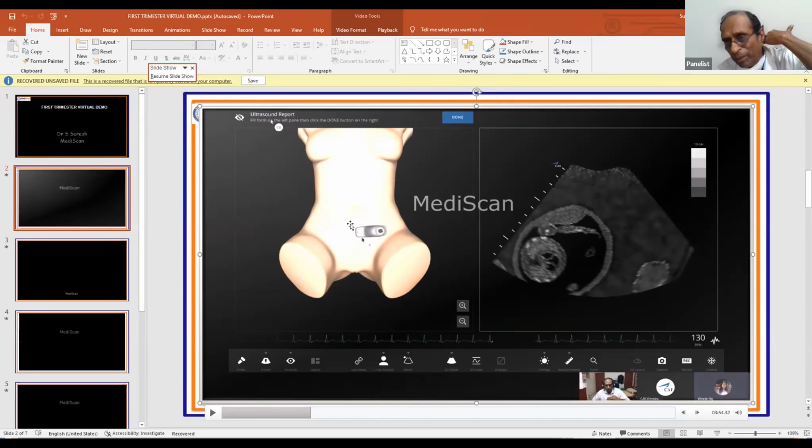From the sagittal spine, if you want to get the head, you get the cervical spine junction, rotate the probe 90 degrees and move forward. So these are things which you will learn as you work on each patient. First, understand the probe movements.